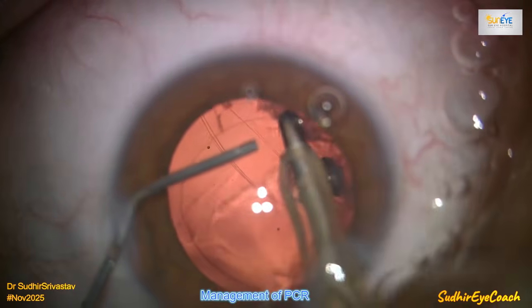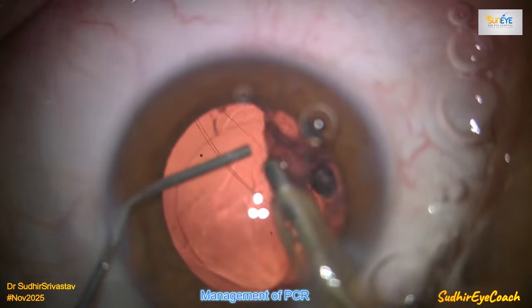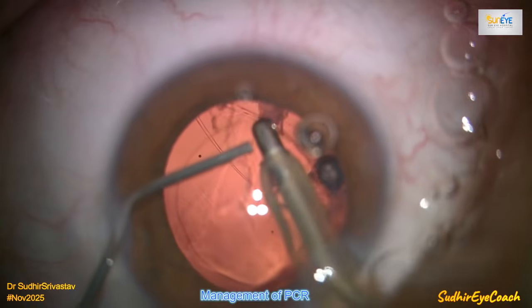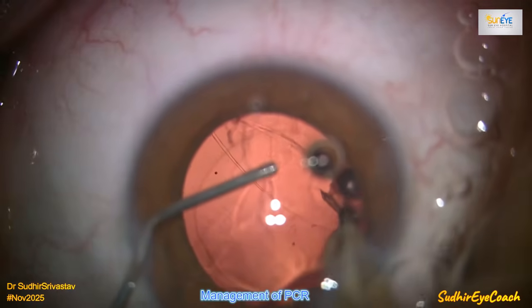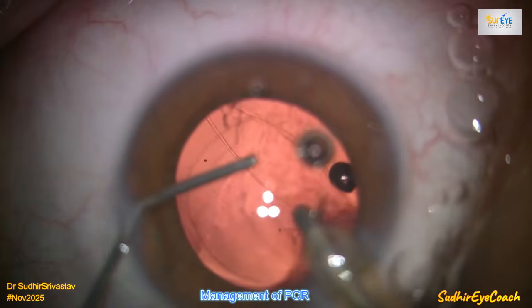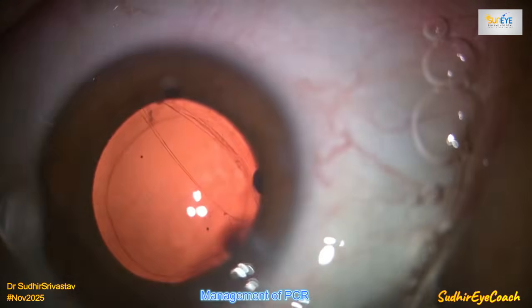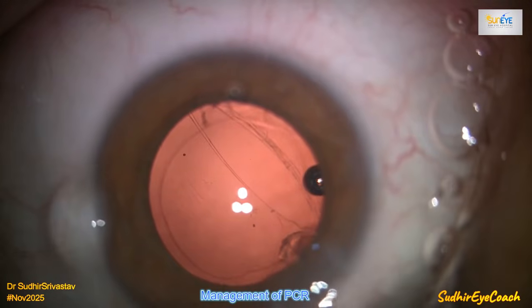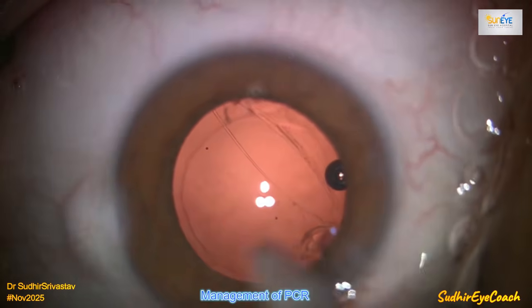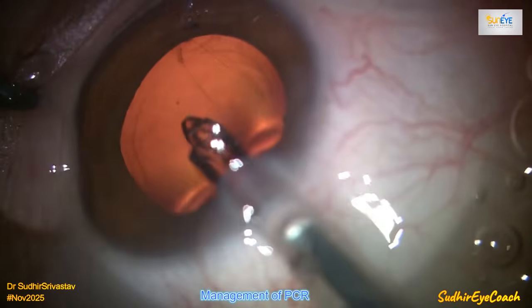Since now I am working in the area of the rent, I used the second instrument, and I used visco ejection along with the irrigation just to maintain the tamponade over the vitreous, so that we can keep the vitreous face intact and there should not be any vitreous movement forward. Now before removing the irrigation aspiration tip, I filled the anterior chamber again with viscoelastic, and now it is time for IOL implantation.